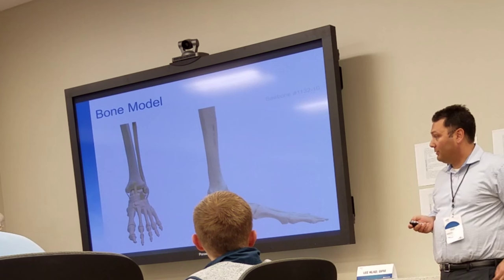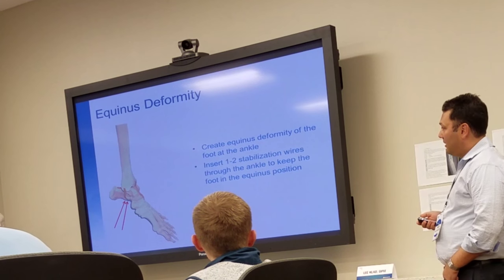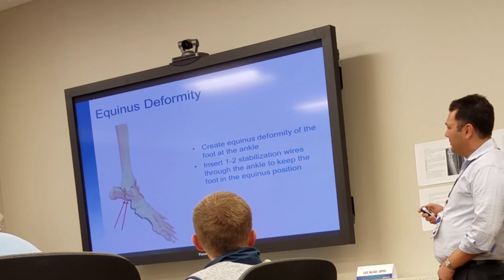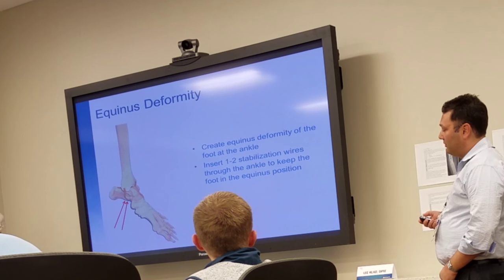You're going to take a look at your bone model and create an Equinus deformity. You'll stabilize this deformity with one to two wires.